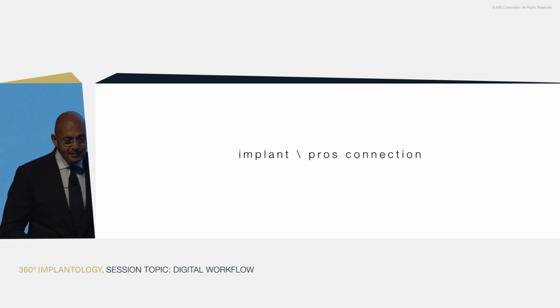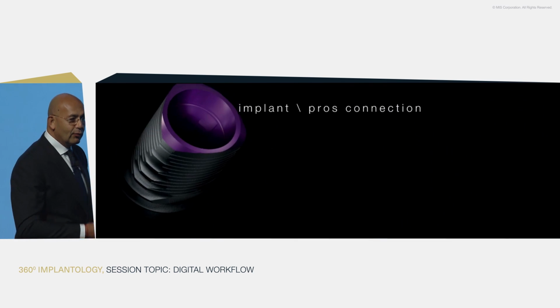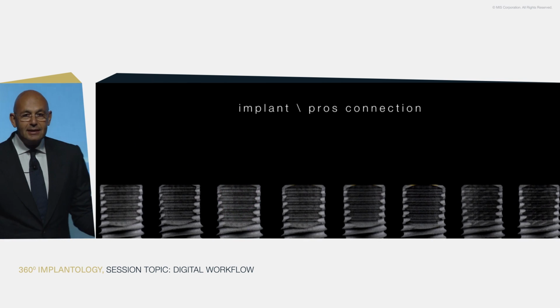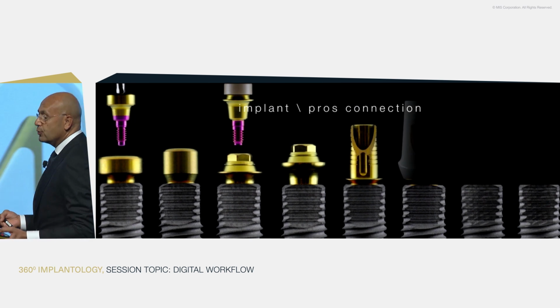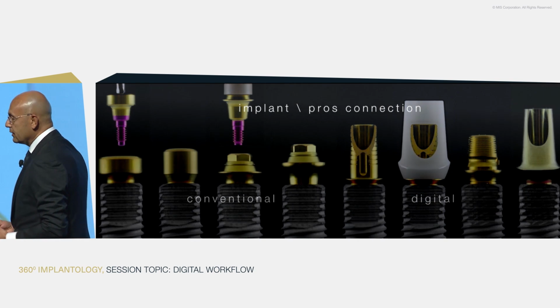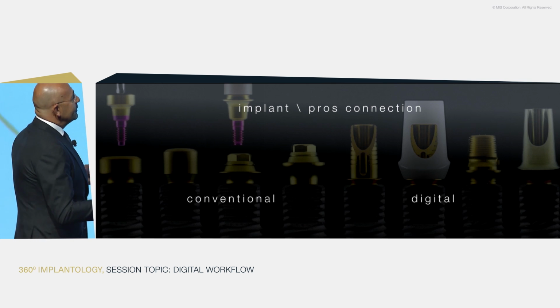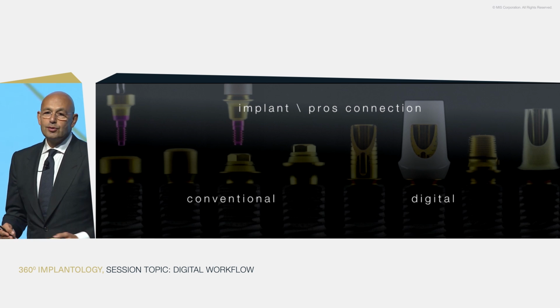My topic today is the implant-prostho connection. When we place an implant, there are things going beyond the surgical phase, such as the abutments we'll be using on top of these implants. So which one to choose, how to choose? I will just try to give you some very simple examples that may help you in your practice as of the next day. Basically, after the implants are done, we have two ways to continue.